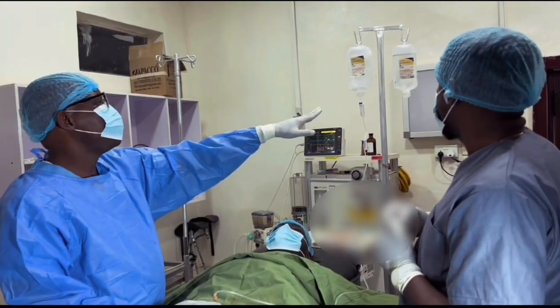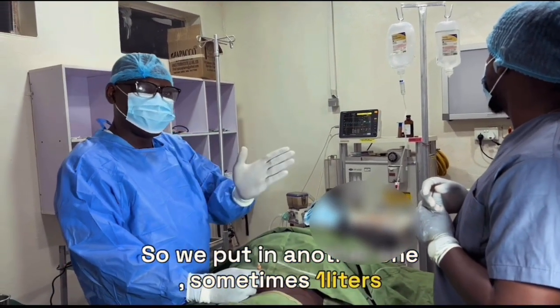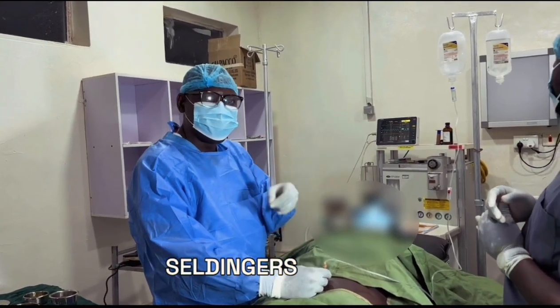We put in 500 mils. This is about finishing. So we put in another, sometimes 1 liter, 1.5 liters, to fill the peritoneum. That will help us to do the Seldinger method.